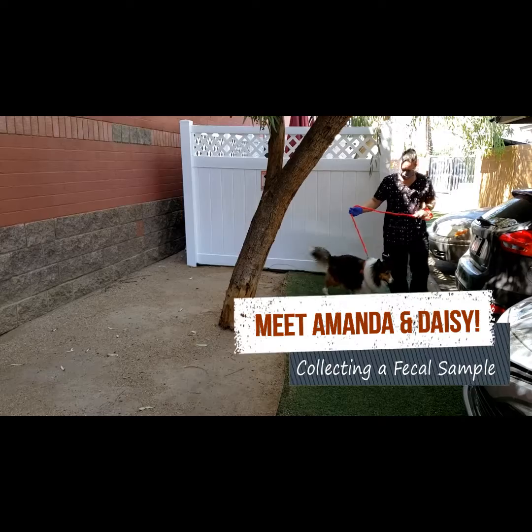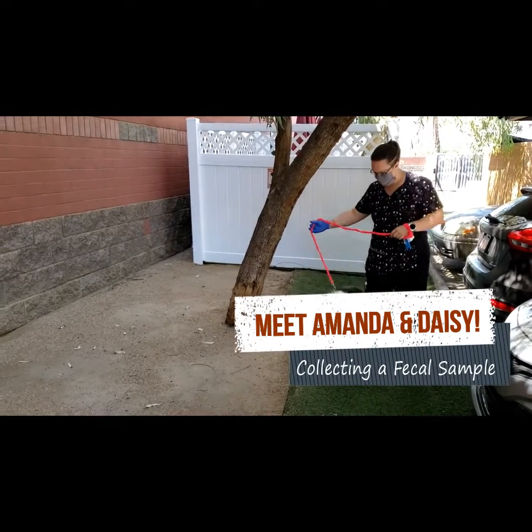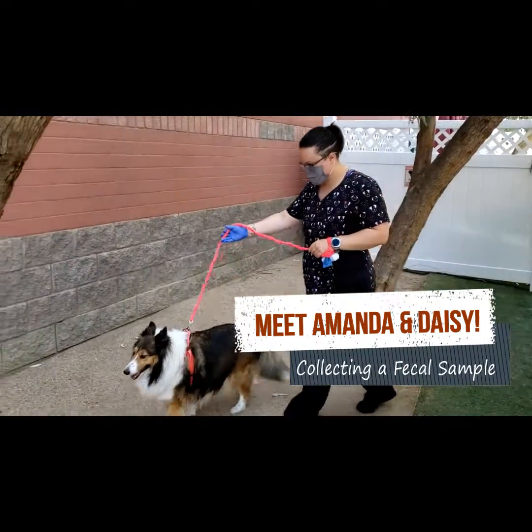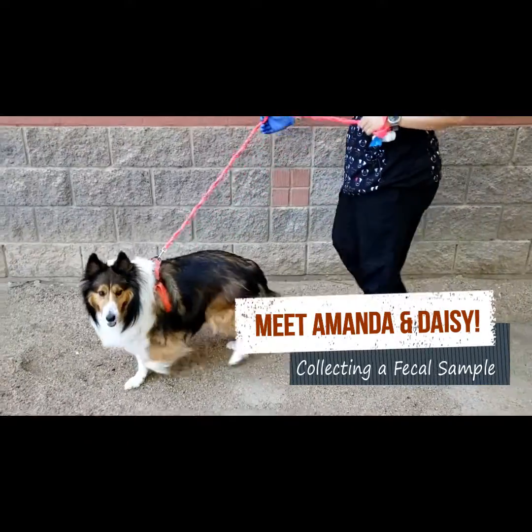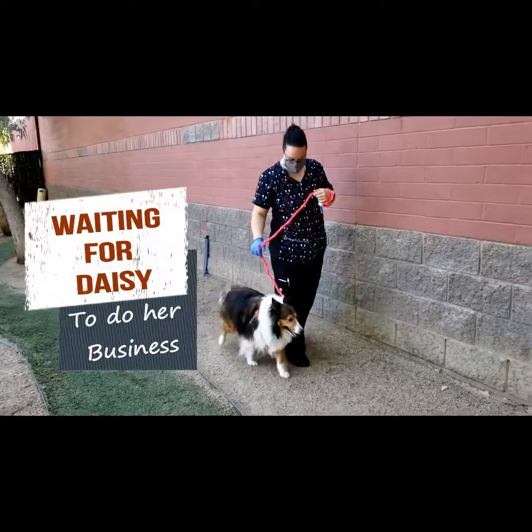Are you ever curious about how to collect a fecal sample for your pet? I have Amanda and Daisy to show us how. Hi, Amanda! Hi, Daisy! First, we're going to let the pet do her business.